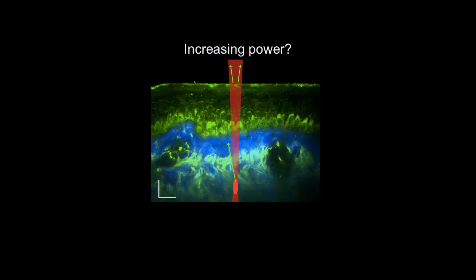Yeah, especially for this application of skin imaging, where the skin is very non-uniform and very undulated, especially at the junction. And then on the top we have these lines, not necessarily wrinkles, but really lines of different refractive indices.